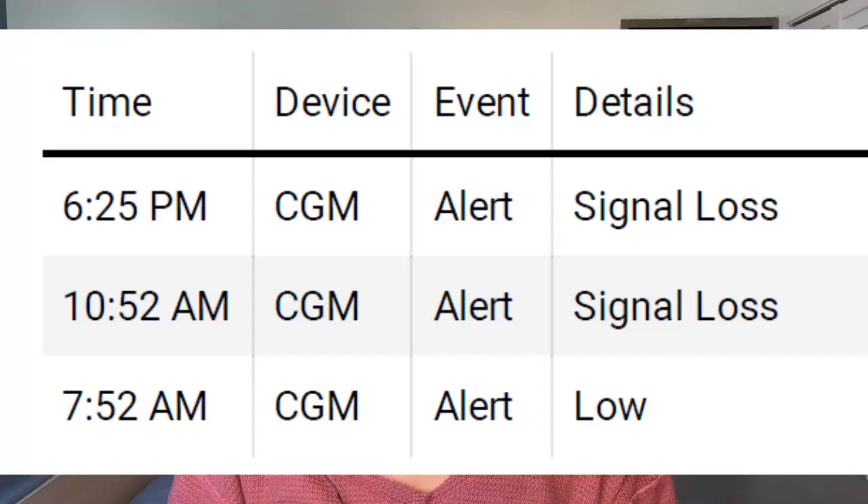I'll also be sharing how Dexcom is intending to fix it on their end. What I realized is that there are times where I have signal loss more frequently than others. So I did what I always do — I dug into my data and tried to identify what I'm doing differently when I don't see signal loss as frequently. I went through my Clarity report. Clarity is the Dexcom reporting software, and I started to see some really interesting patterns.